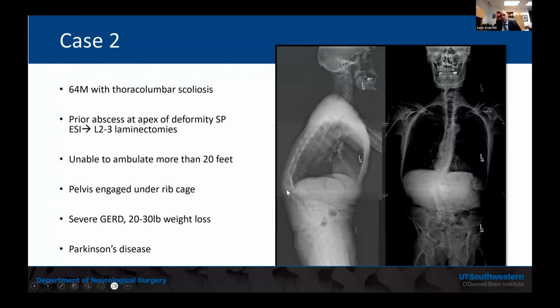And this is after our dissection work. We're pleased to see that even the laminectomy side matched with the model. And this is after we're done. The planning that this allows us to do is, you plan where your dual head screws are, where your connectors are, and you plan how many bolts you put in and where. And he was extremely happy when we were done.